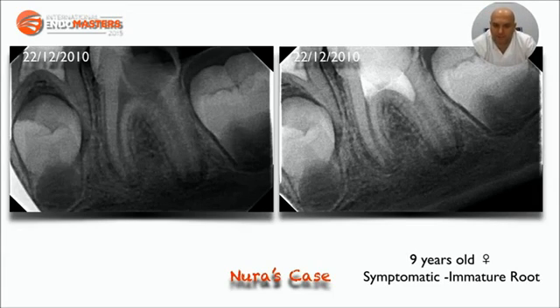Symptomatic immature pulp tissue inflammation in a mandibular molar in a 9-year-old girl is consistent with clinical irreversibility. The objective of dental pulp complex regeneration here will be to preserve the radicular pulp vital in order to achieve apexogenesis. Pulp exposure in Noura's case was over 5 mm in diameter with signs of prolonged bleeding.